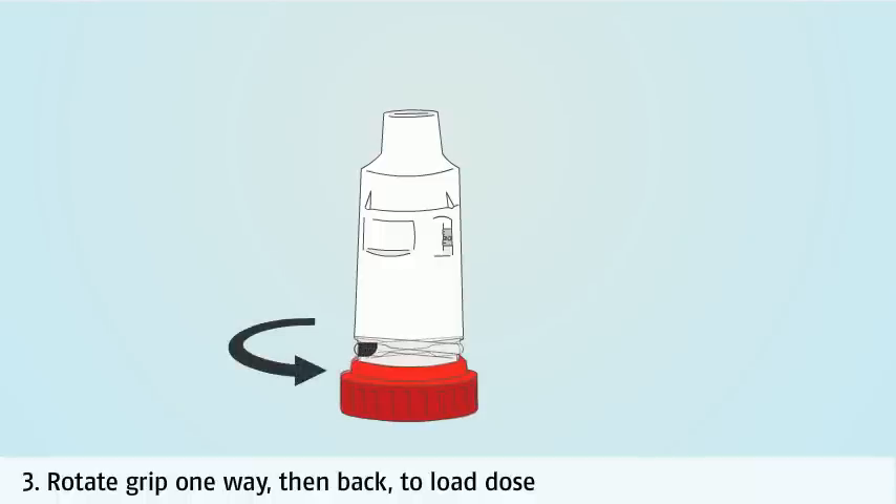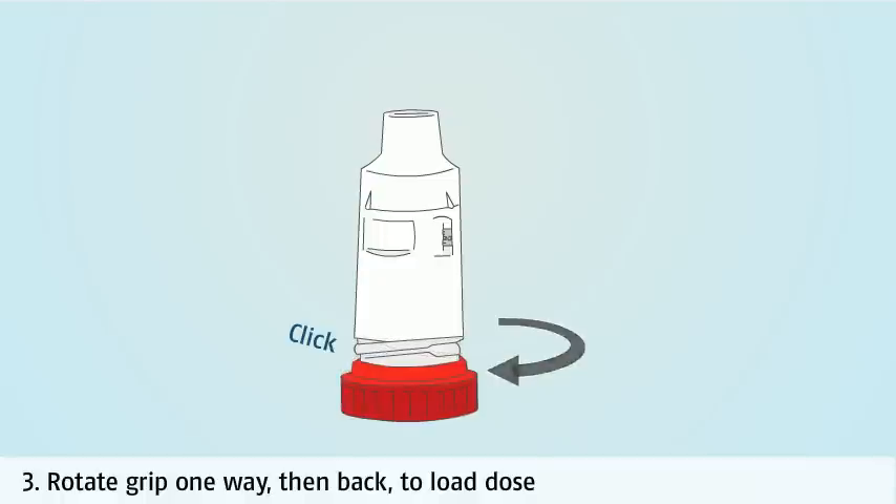Rotate the grip at the bottom of the inhaler one way, then turn it back to load the dose. As the grip is turned back the other way, the dose is brought into position ready for you to inhale. You will hear or feel a click.